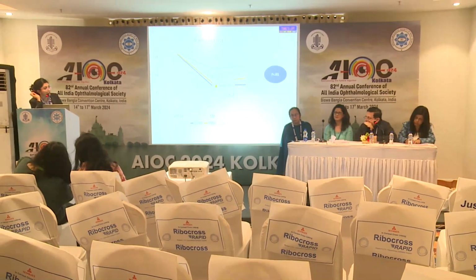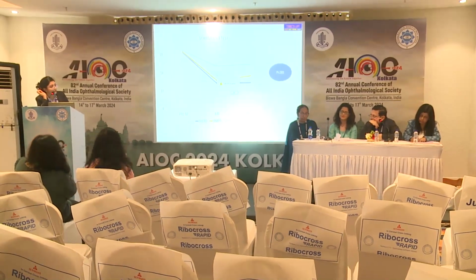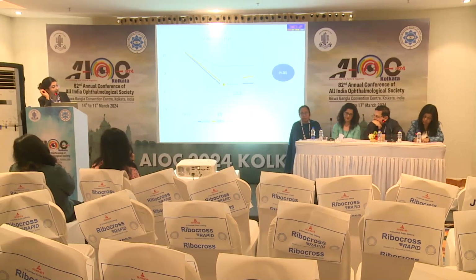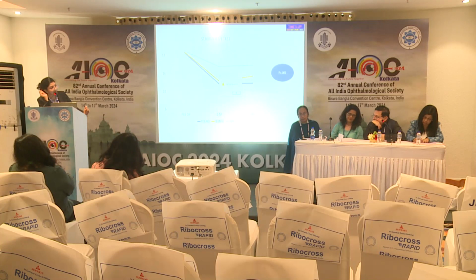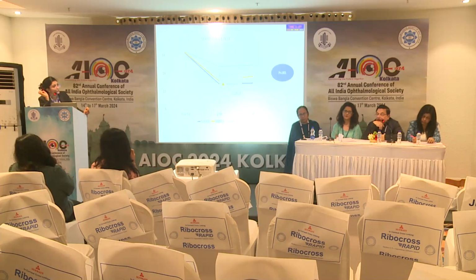What about epithelial thickness? Did you study? Yes, ma'am. Actually, we saw a slight increase in the epithelial thickness in the femtoLASIK group. But as studies show, there is slight epithelial re-thickening of 10 to 15 microns after femtoLASIK. There is literature which shows this. I think the trend now is to go for epithelial thickness in all cases. Yes, sir.